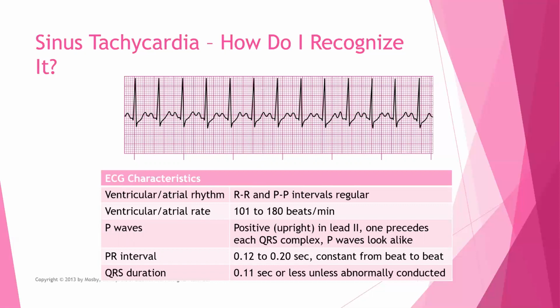Let's see if we can find one that is just on a solid line. Okay, it's pretty close. So if we look at the 3rd beat from the end, so all the way down the strip to the 3rd beat from the end, that's pretty close to landing right on that solid line. Let's do that sequential counting down method, right?